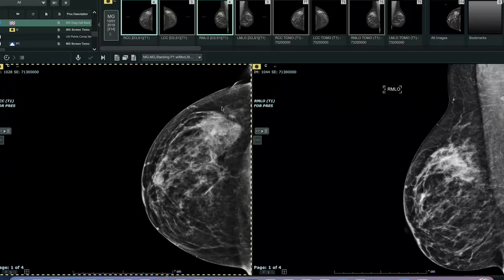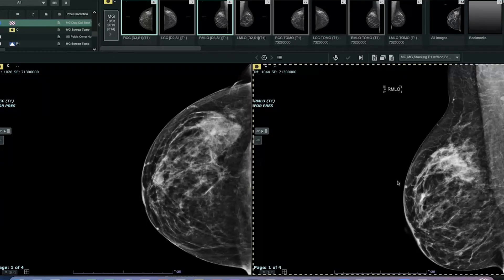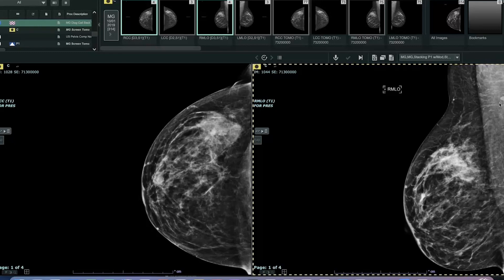This is the CC view with the patient compressed from top to bottom. This is the lateral part — the outside part of the breast. This is the inner part of the breast. This is the nipple here. This is the MLO view, which is approximately a 60-degree angle view, where this is the top of the breast, this is the bottom of the breast, this is the nipple, and this is the chest wall or pectoralis muscle. You can also see a glimpse of some lymph nodes in the axilla.